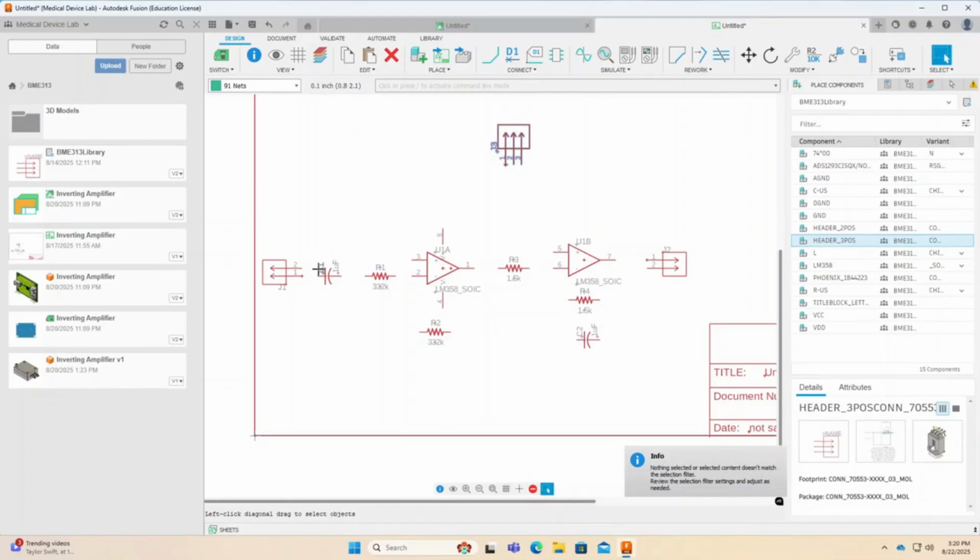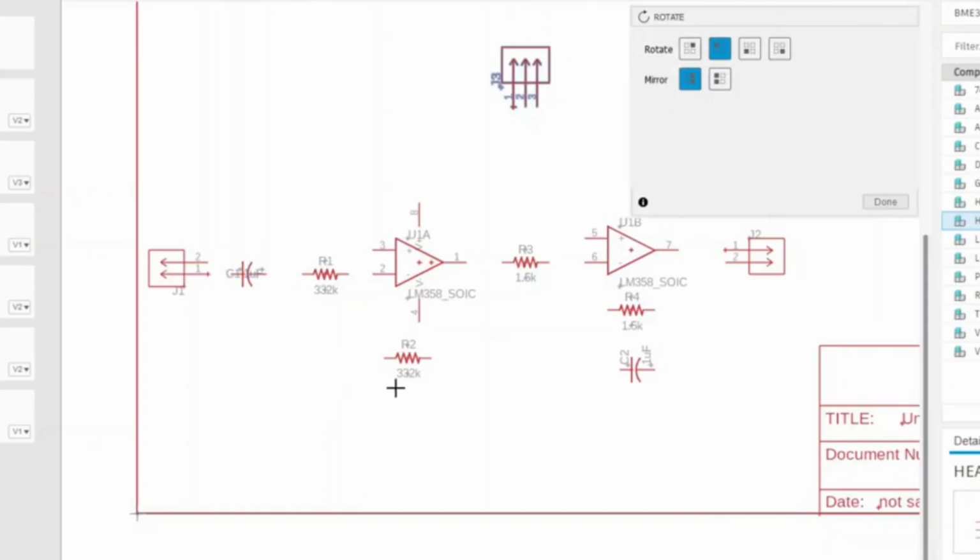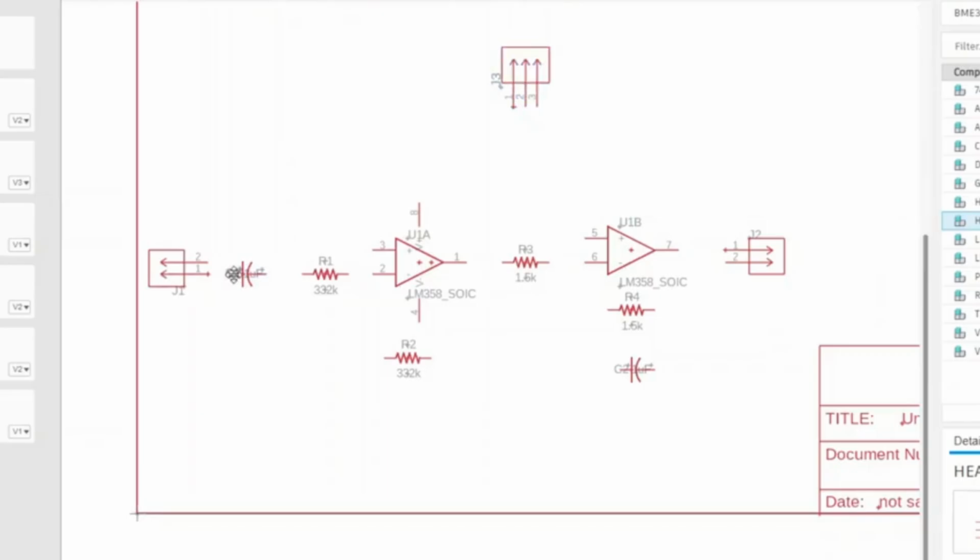Adjust the orientation of the labels so they read horizontally. Right-click the label and select Rotate. Click Other Labels to rotate. Move the labels to ensure they're clearly visible.